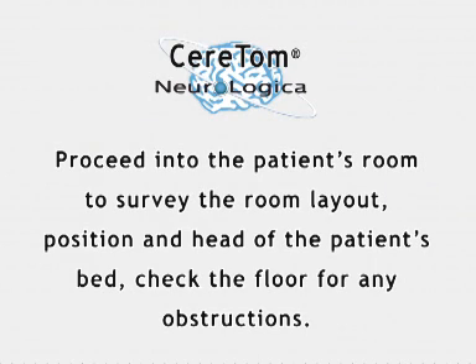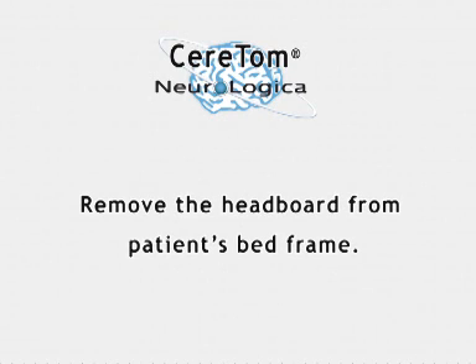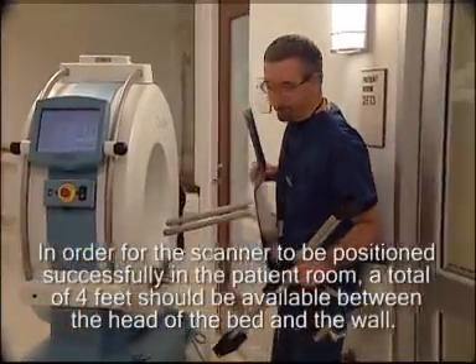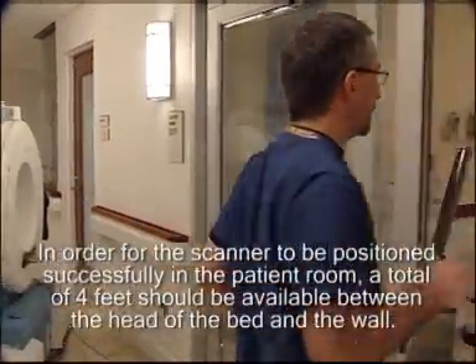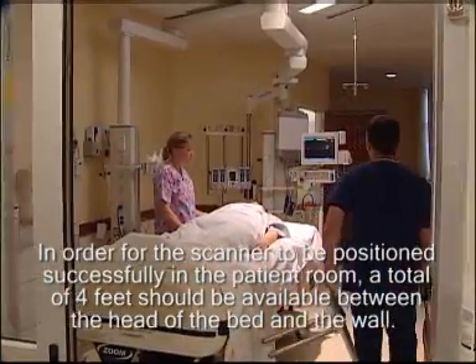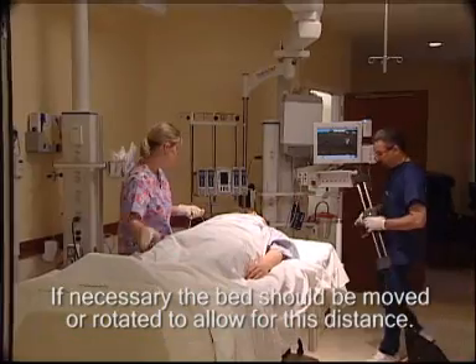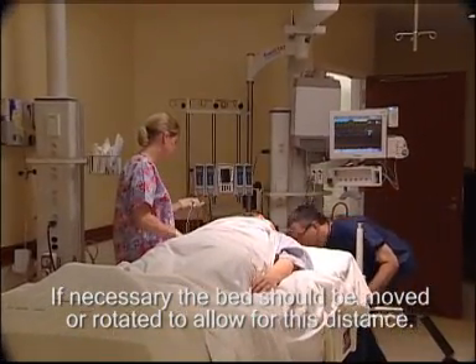Check the floor for any obstructions. Remove the headboard from the patient's bed frame. In order for the scanner to be positioned successfully in the patient's room, a total of 4 feet should be available between the head of the bed and the wall. If necessary, the bed should be moved or rotated to allow for this distance.